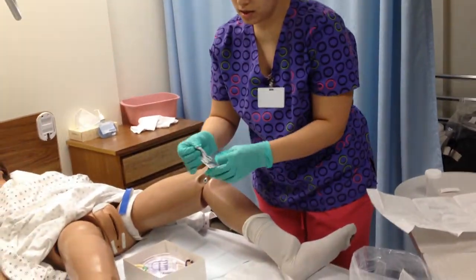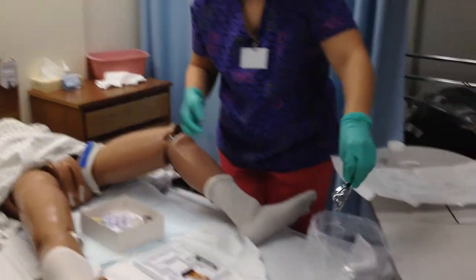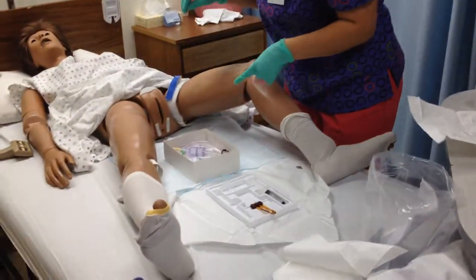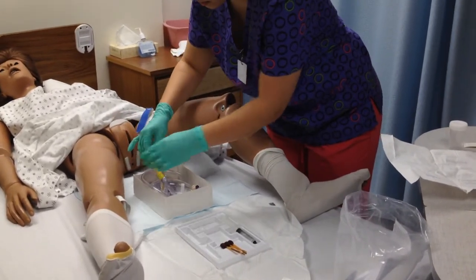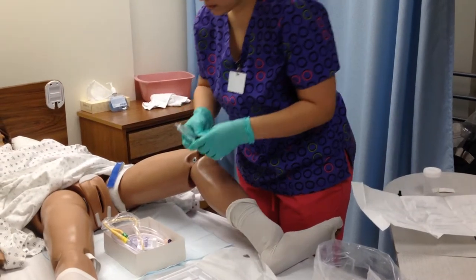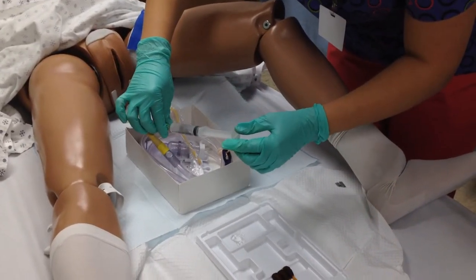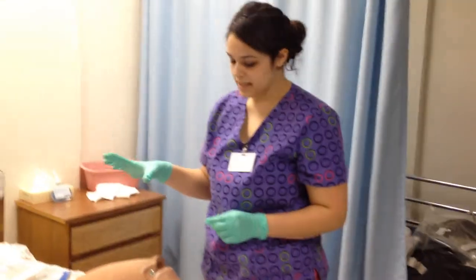Take my lubrication, put it in the tray. That fell outside my sterile field, right in the 1-inch border. I'm now gonna check the patency of the balloon. It is intact and inflates. Okay, so now I'm going to contaminate my non-dominant hand.